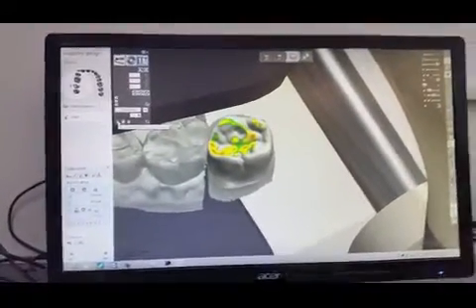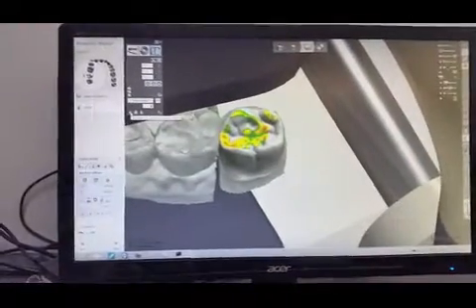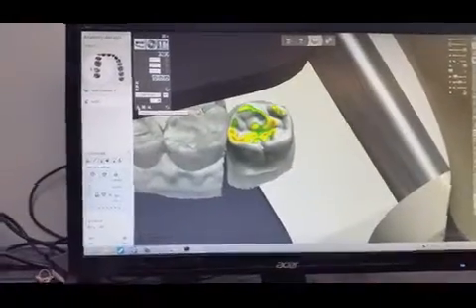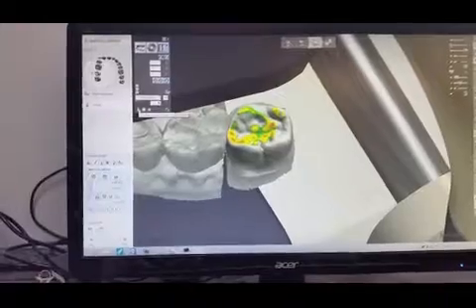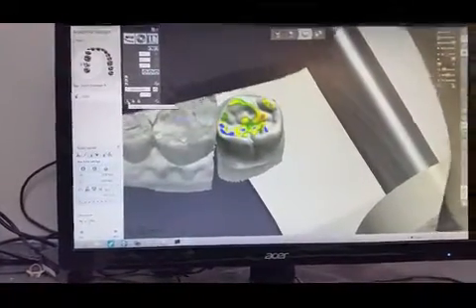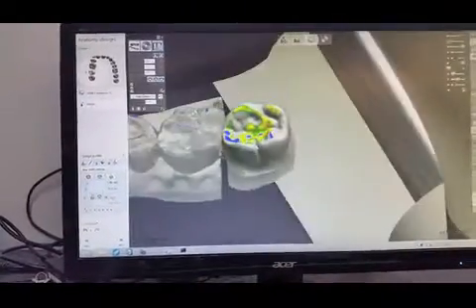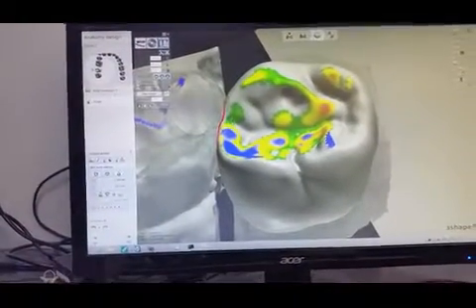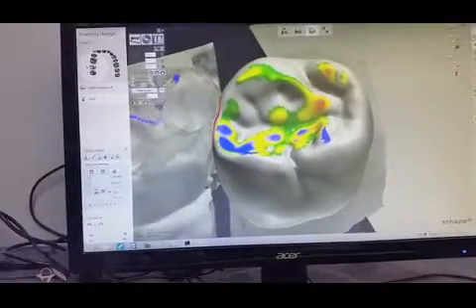And once I hit this green button, the articulator is going to start going into lateral movement, and if there is any contact on lateral movement with the crown, it's going to put it in blue. Then I will have an option to clear that or just skip it. There, that blue is where the opposing is hitting the crown on lateral movement, which we're going to clear.